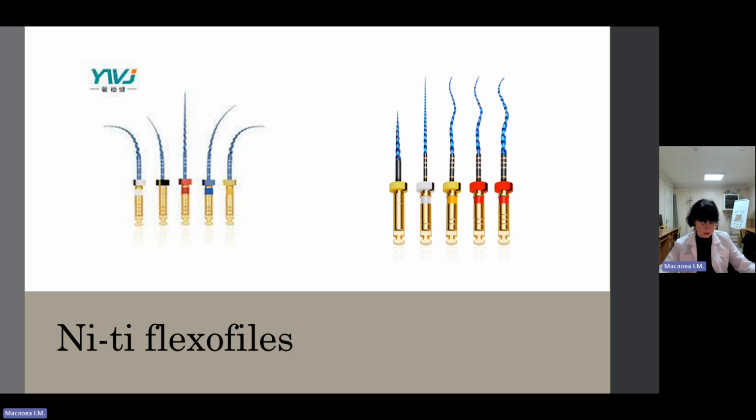Exact placement of 37% phosphoric acid gel for 60 seconds on the calcified orifice may be helpful as well. The access cavity preparation is complete when the root canals have been located and are accessible for treatment.